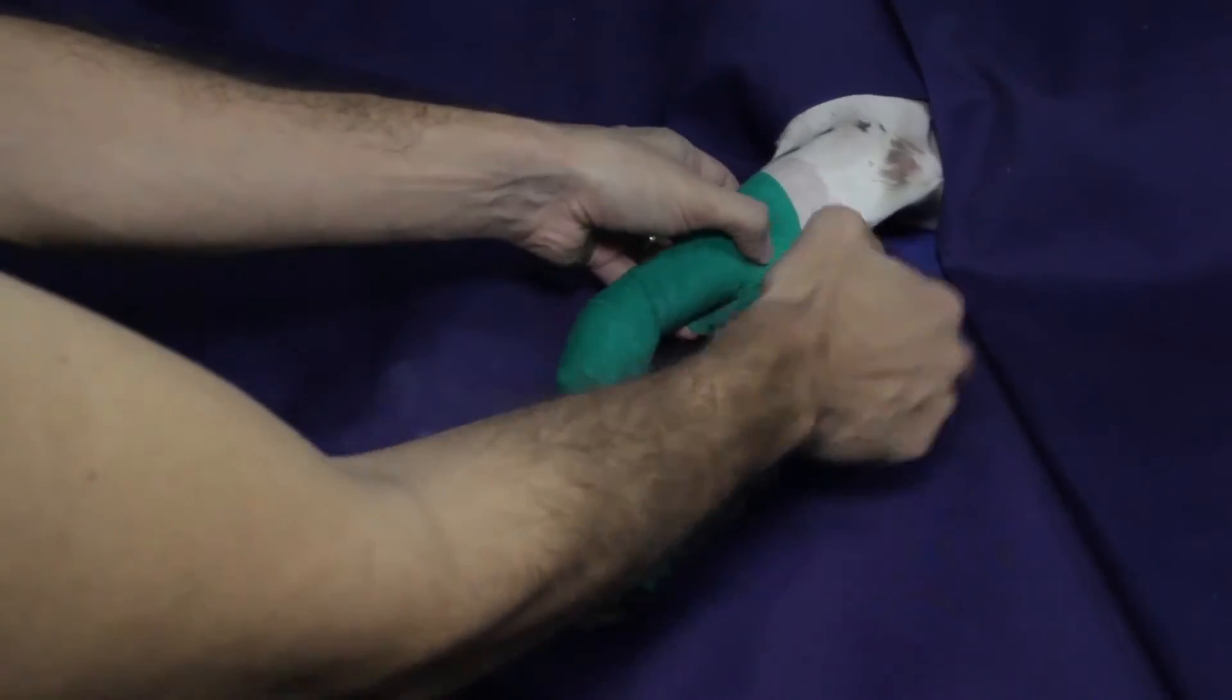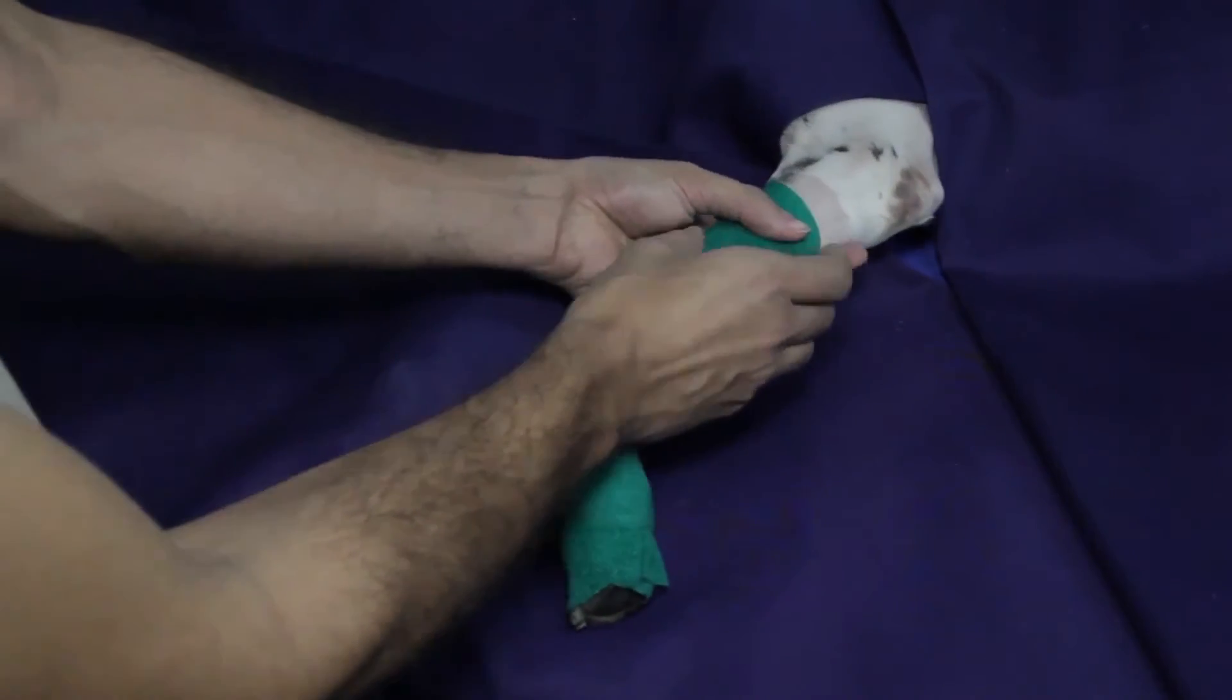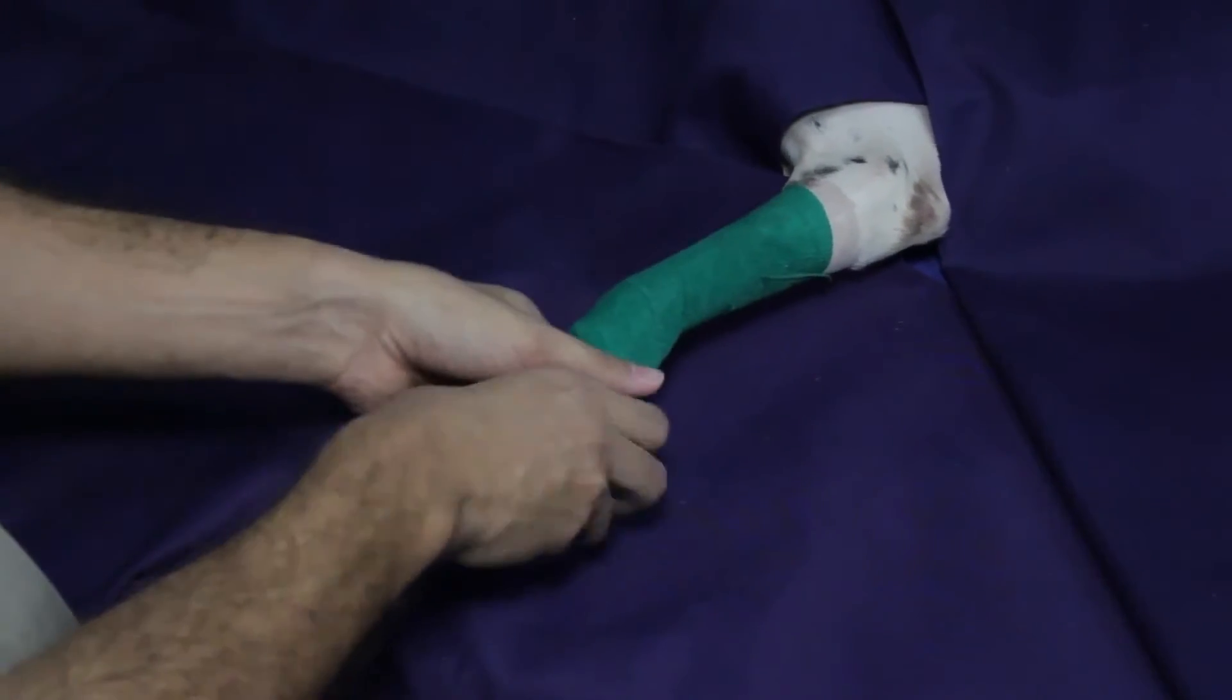Pulses are not palpable when the tourniquet is applied in a proper manner. This will aid with hemostasis during the surgical procedure.